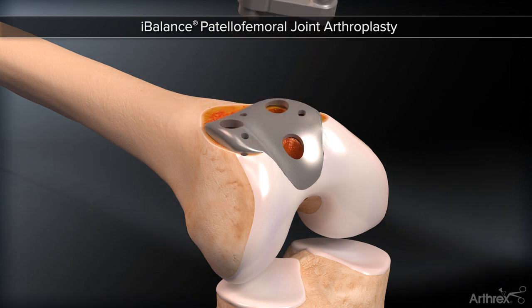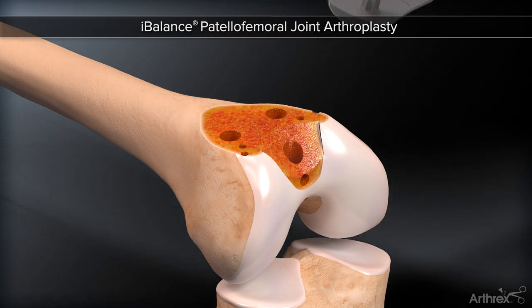An optional trial may be used, or one can proceed with standard cementation.